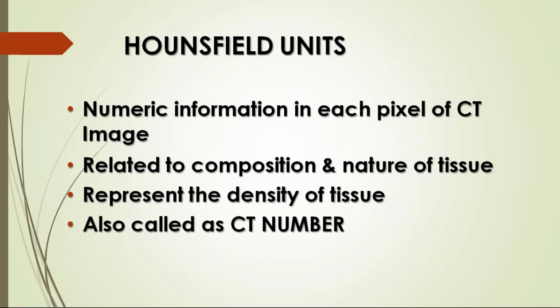Please note it down about this Hounsfield unit. If you know it, you can get it in your NEET exams also. I think you are going to write the next exam, I think.